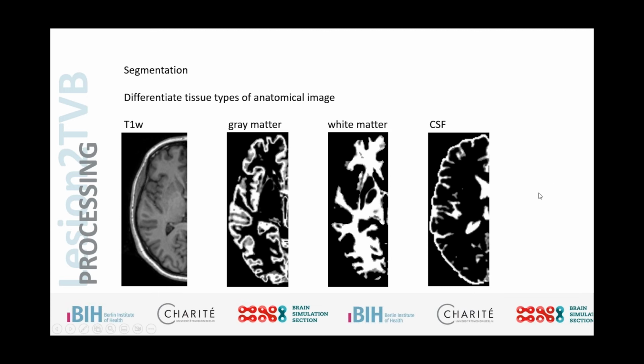We have to manually add this pathological tissue type, because automated segmentation algorithms, currently a lot of them using deep learning algorithms, do not fulfill quality requirements if we're talking about a clinical context. So this is an ongoing, very active research field.